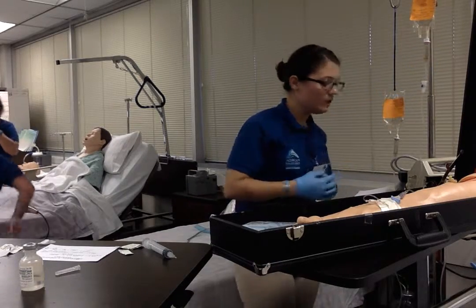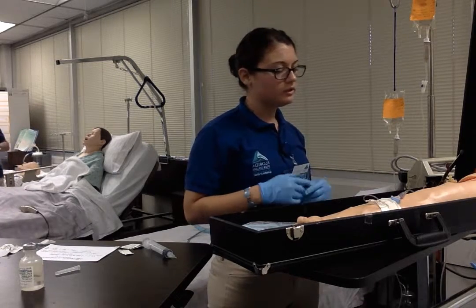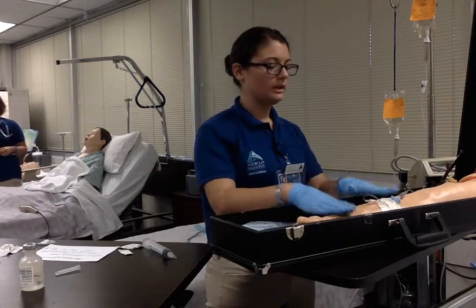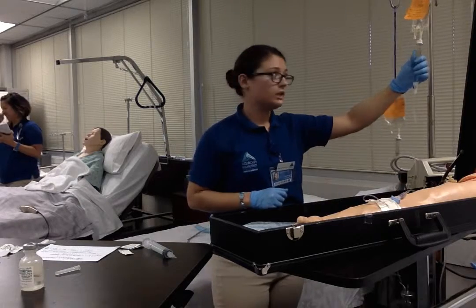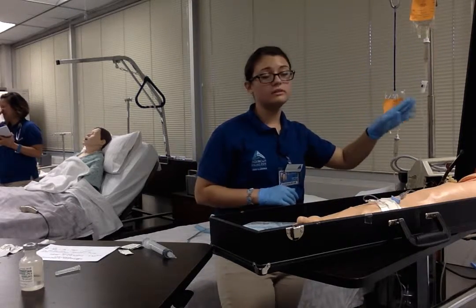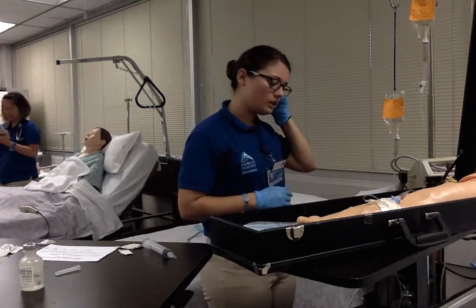Mr. Jones, I had let you know some of the things that we're going to start monitoring for. You're not feeling weird or anything, no allergic reactions. Your site looks good. Everything's still going well. Always want to make sure that any medication or bags that you hang is still intact and running before you leave. So there's nothing going on.